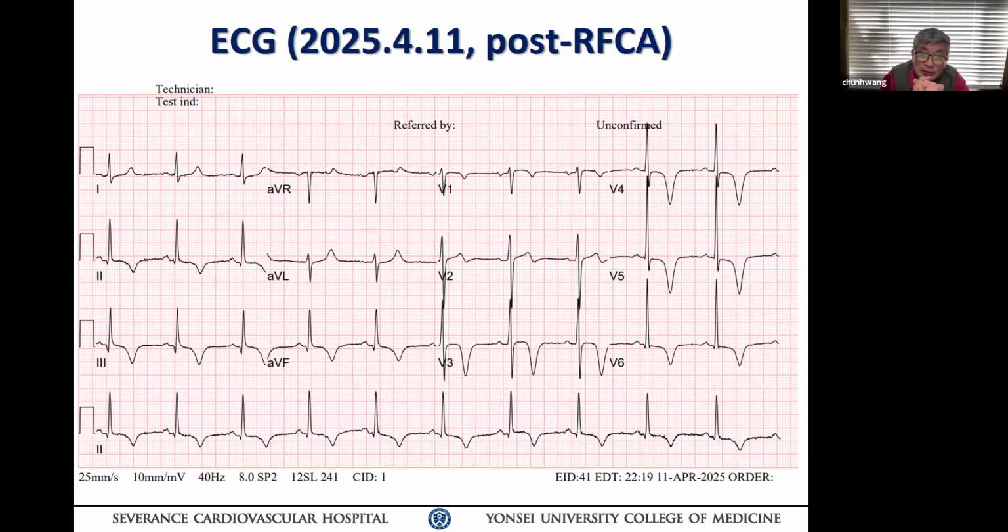So when do you see symmetric T-waves, guys, most commonly in your practice? Ischemia, but you ruled it out already, right? So why does T-wave inversion happen in an ischemic event? Because your myocardial infarction is typically subendocardial, and your epicardium is somewhat spared. That's typically called a symmetrical waterfall T wave or cerebral T wave.